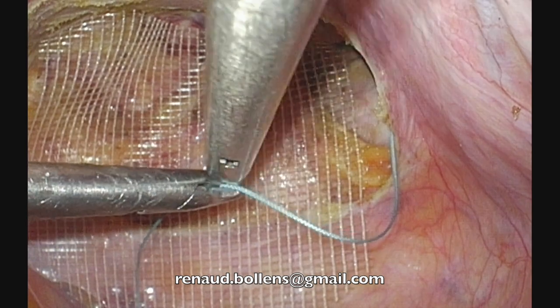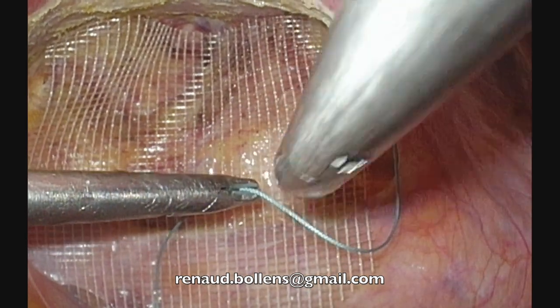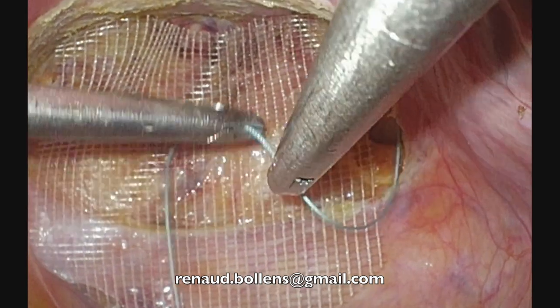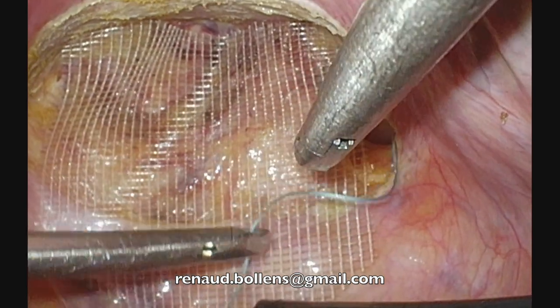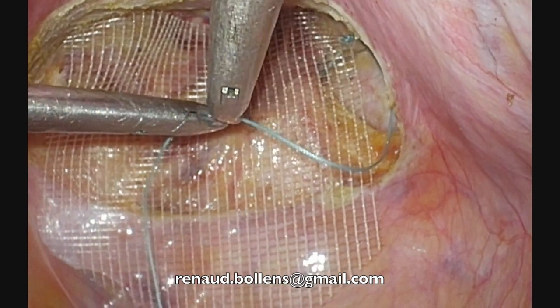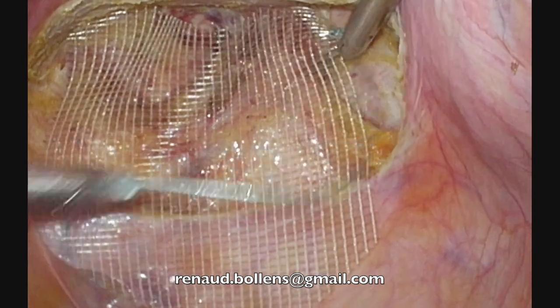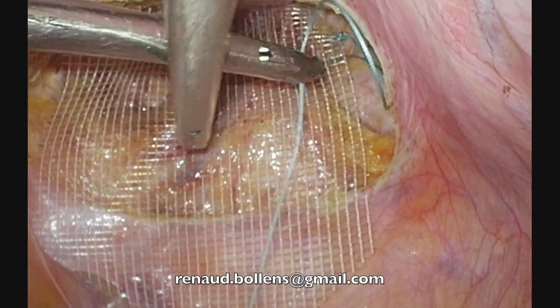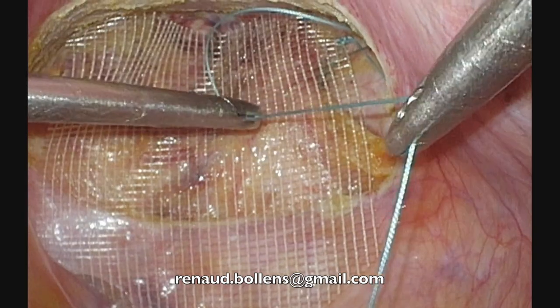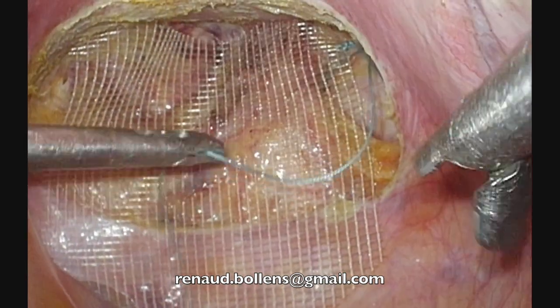Then the plane of the jaws must be placed in such a manner that you can enter in the plane with the right needle driver. Don't place like that. Don't place like that. You have to turn in this position. Of course, we turn around the suture that goes from the fixed point to the needle driver, not from the needle driver to the needle, okay? Fixed point to the needle driver.